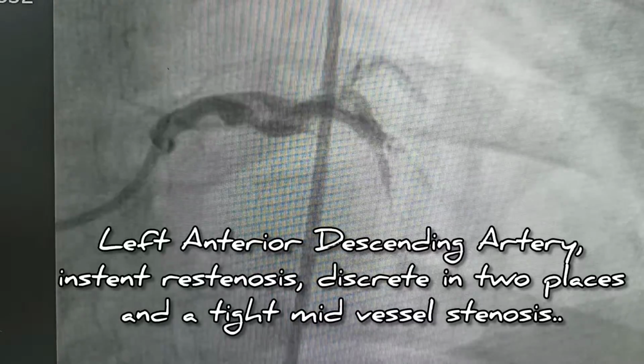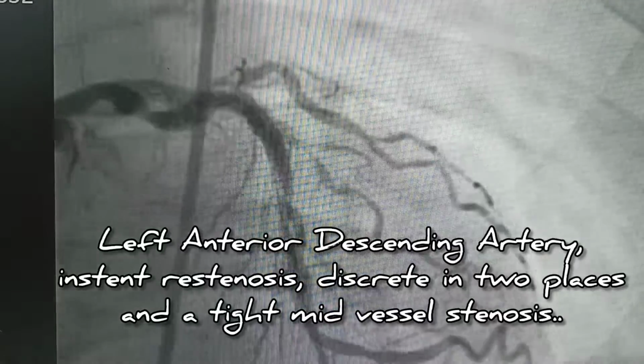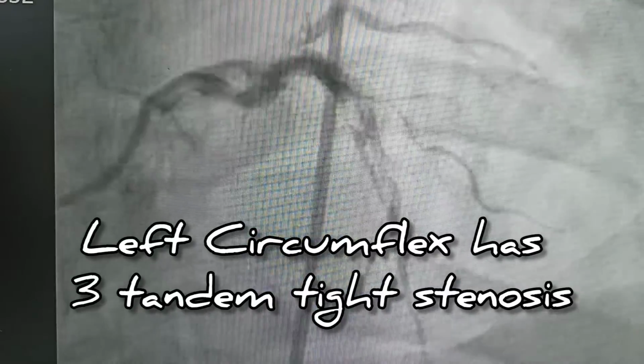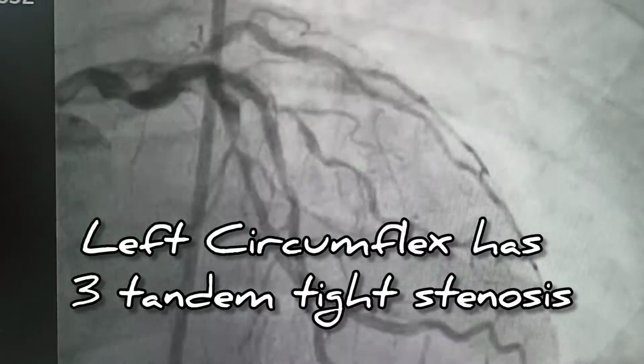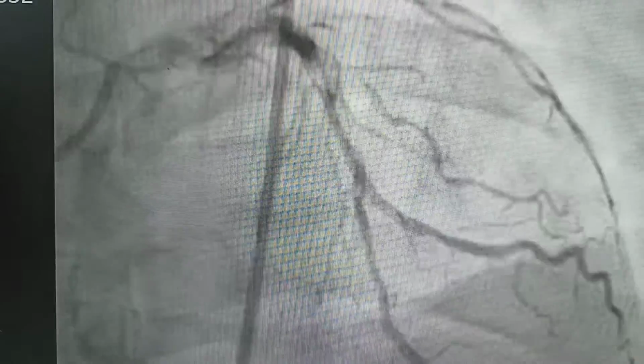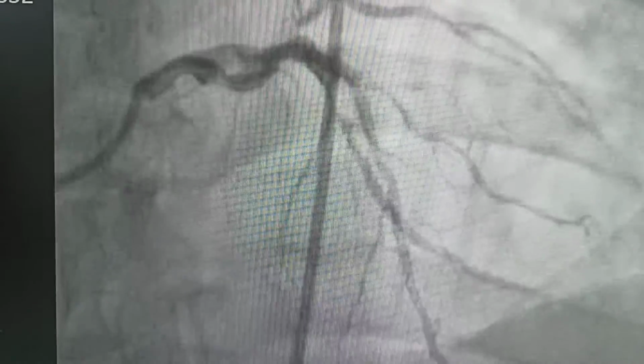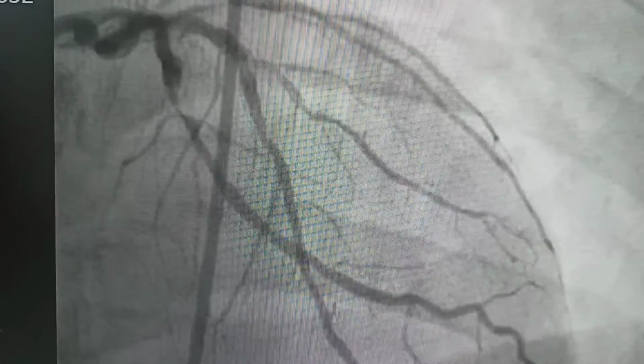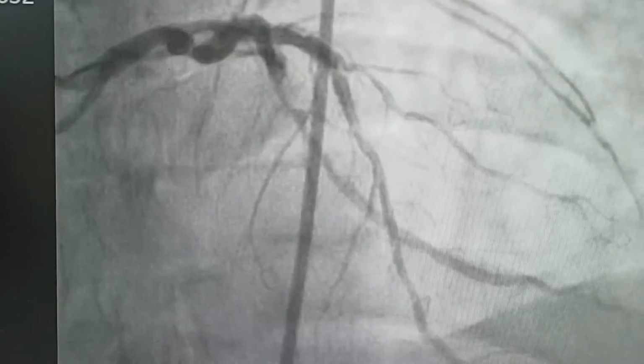Given the complexity of his disease in the coronary arteries, the coronary angiogram was stopped here, and I did not proceed to do an ad hoc angioplasty or stenting. The proper decorum here is to discuss the complexity of his coronary tree the next day in clinic with the patient and offer him the alternative and full modalities of treatment.